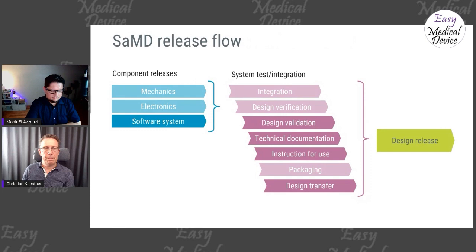Okay, so if you have software as a medical device, is that different? Well, kind of not, because of course you don't have mechanics and electronics, that's pretty obvious, but the software system is still delivered into system integration, in terms of there will be technical documentation, there will be instructions for use, there might be design validation.